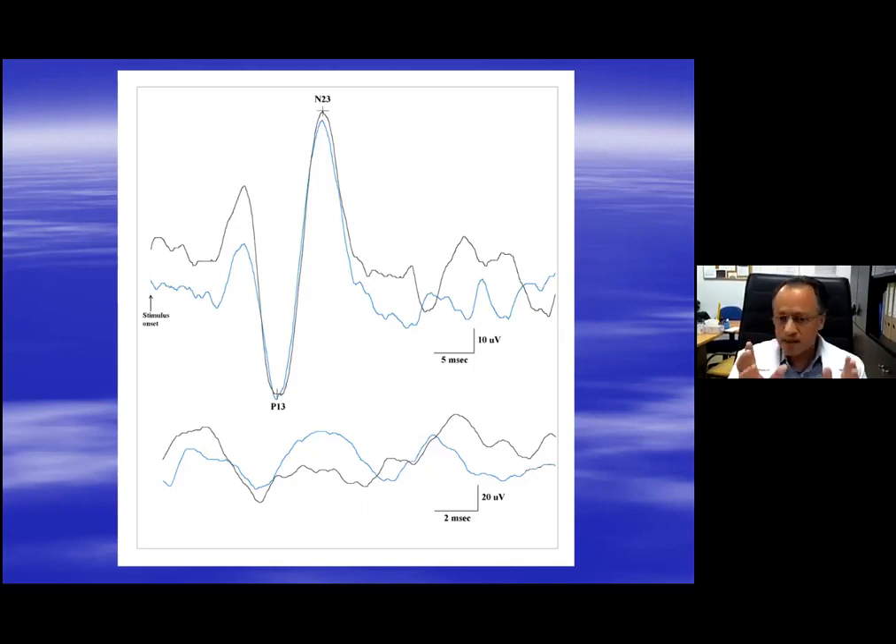When I say EMG, I am not talking about needle electrodes. I am talking about the same surface electrodes that you are using to record the C-VEMP. What I do on my system — because every laboratory has their own system — this is actually a sensory nerve conduction study recording. The reason I am using a sensory nerve conduction study recording is that it allows me to do a rectified recording.